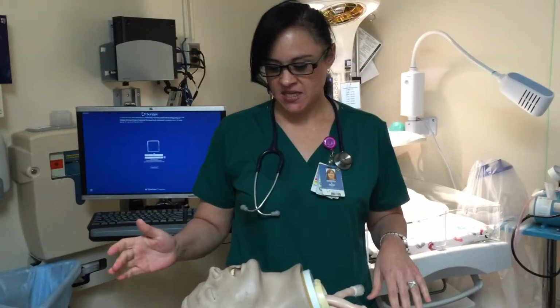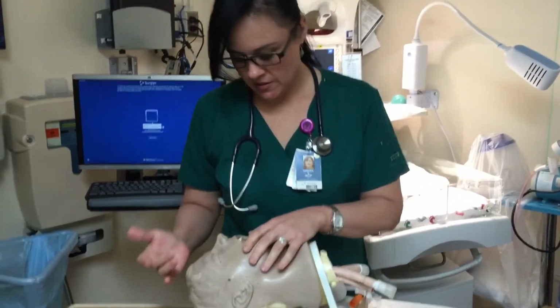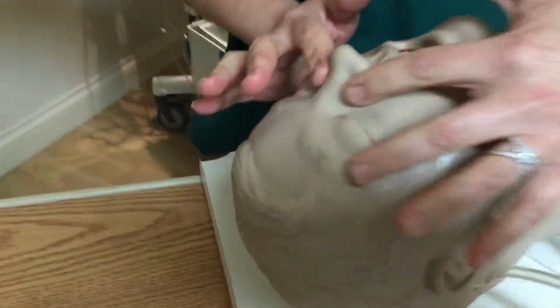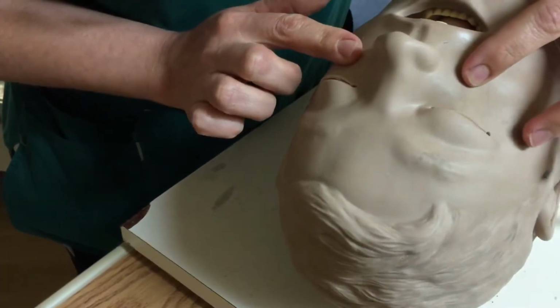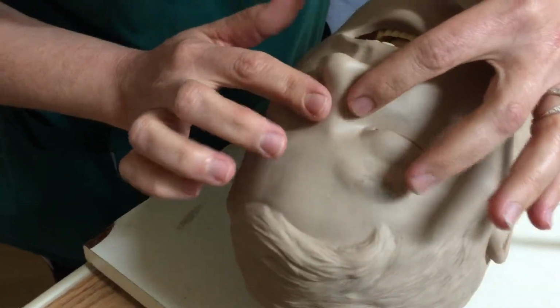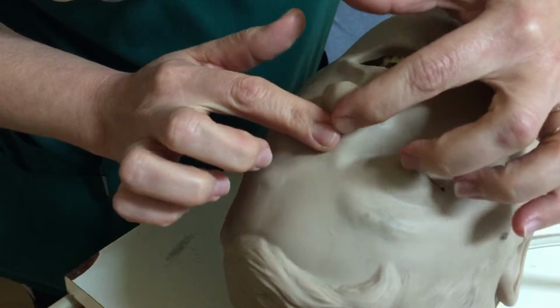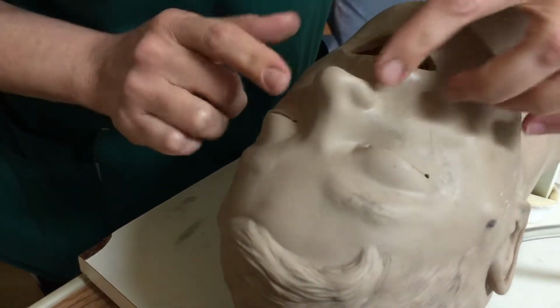So before we start the BiPAP, we're going to inspect the skin. So we're going to look at the skin itself. We're going to look especially in the nose area and the nasal bridge to make sure, like if they're in the ER, if they come in from the field and they're prior on CPAP, they might have some redness already here and here. So if there is, we're going to notify the nurse and document.